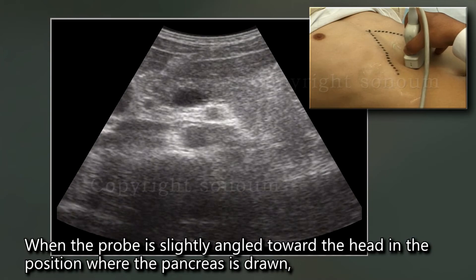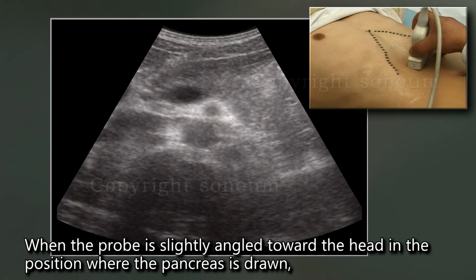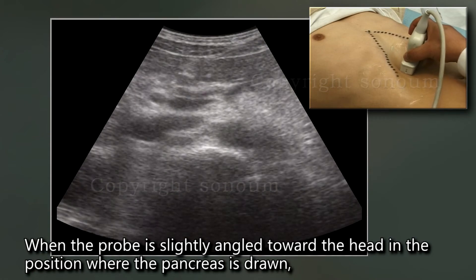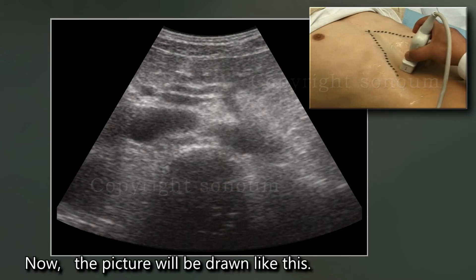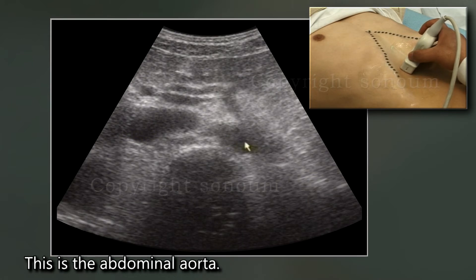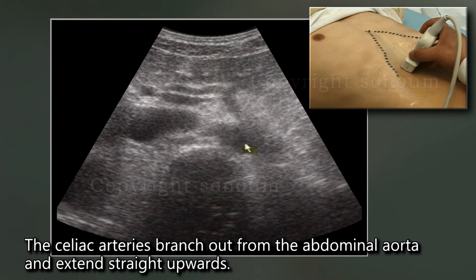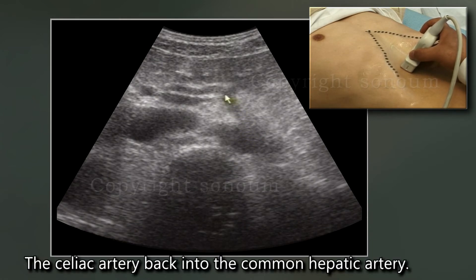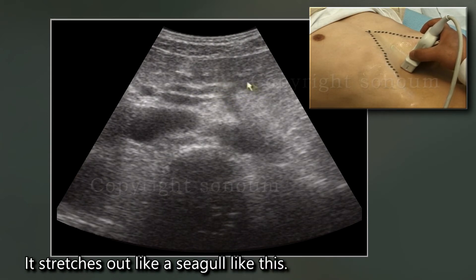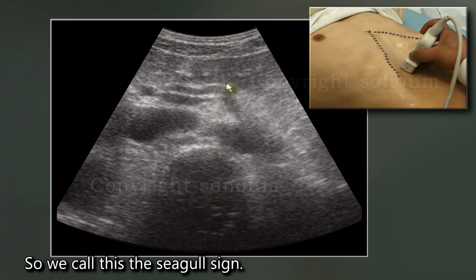When the probe is slightly angled toward the head from the position where the pancreas is drawn, the picture will look like this. This is the inferior vena cava. This is the abdominal aorta. The celiac arteries branch out from the abdominal aorta and extend straight upwards, branching into the common hepatic artery and into the splenic artery. It stretches out like a seagull, which is why we call this the seagull sign.